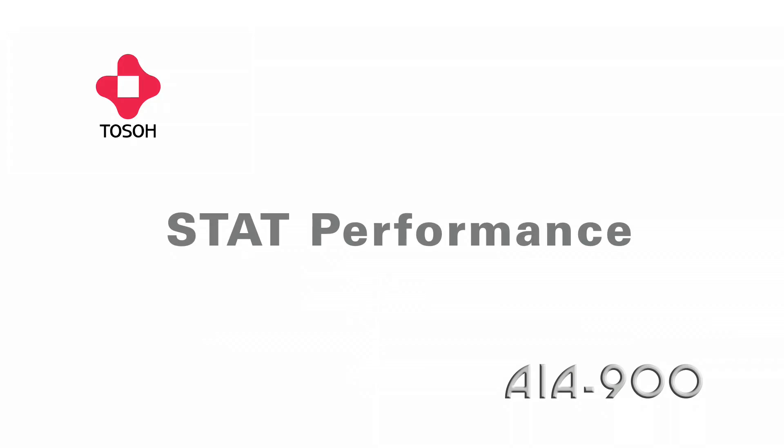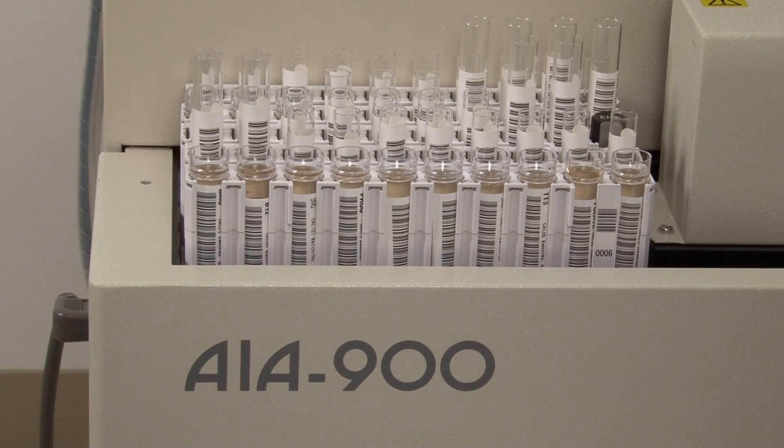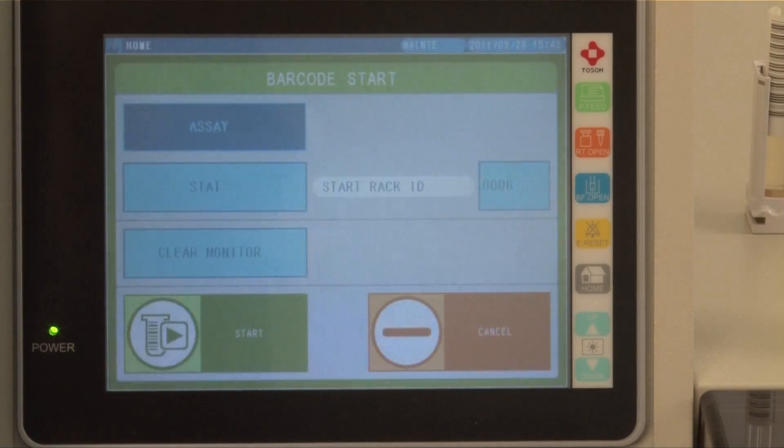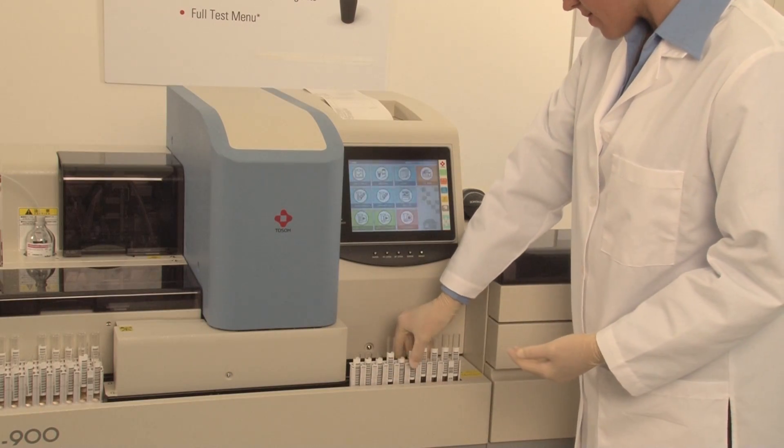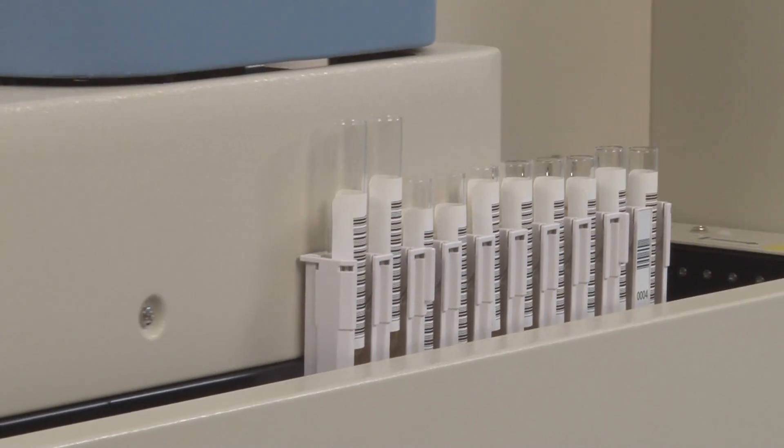Stat performance. Multiple stat processing is available on the AIA 900. To run a stat test, the operator simply chooses the priority rack option and places the sample rack on the instrument.